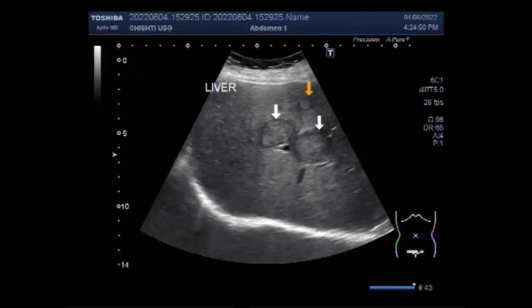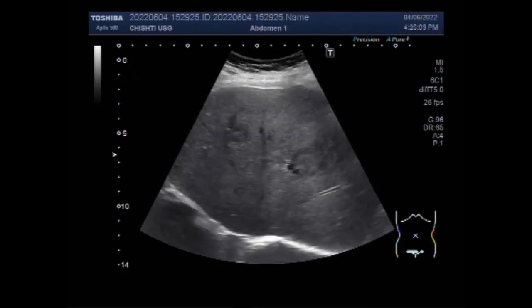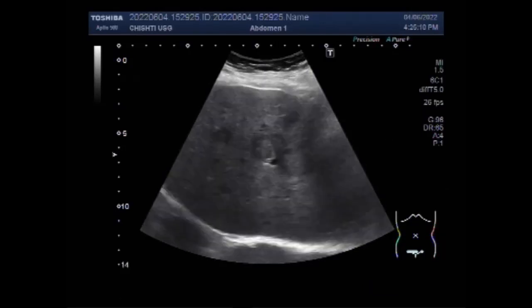The ultrasound appearance of liver metastasis can have bewildering variations, and the presence of hepatic steatosis can affect the sonographic appearance. Hepatic adenomas can be caused by long-term oral contraceptive use or synthetic testosterone use.